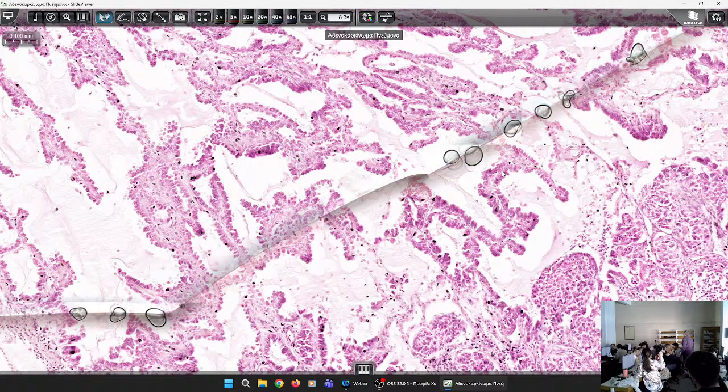So it's not going to stay like that for a long time? It can stay. Paradoxically, yes. But in this case, you'll have the X-ray, and you won't see a tumor. You will see these diffuse infiltrates. Why? Because you have the lining of the alveoli being replaced by abnormal cells.